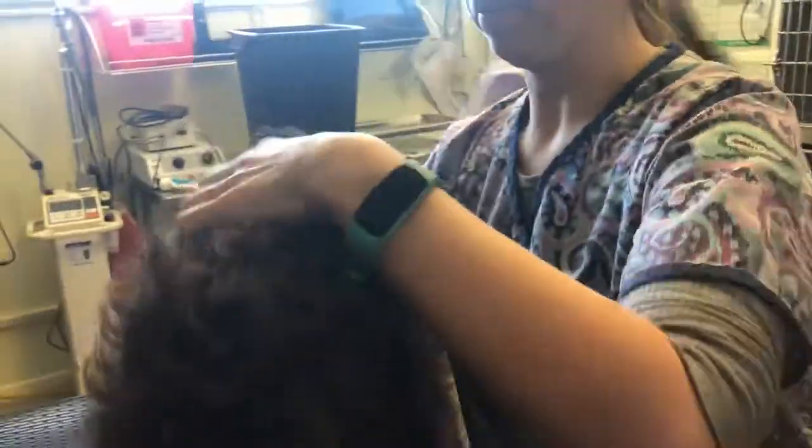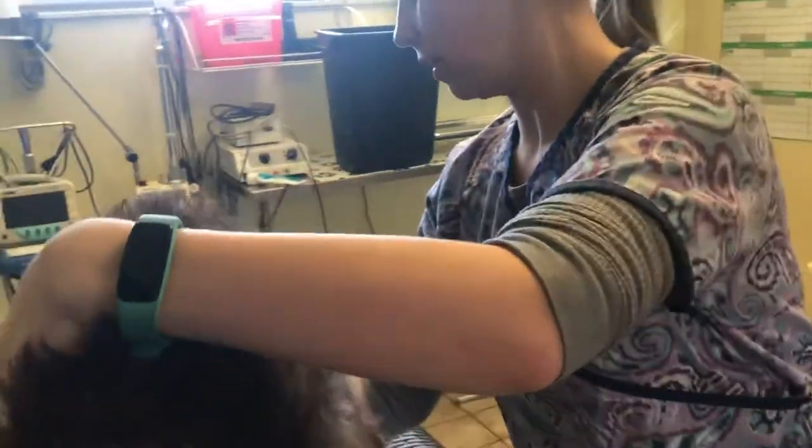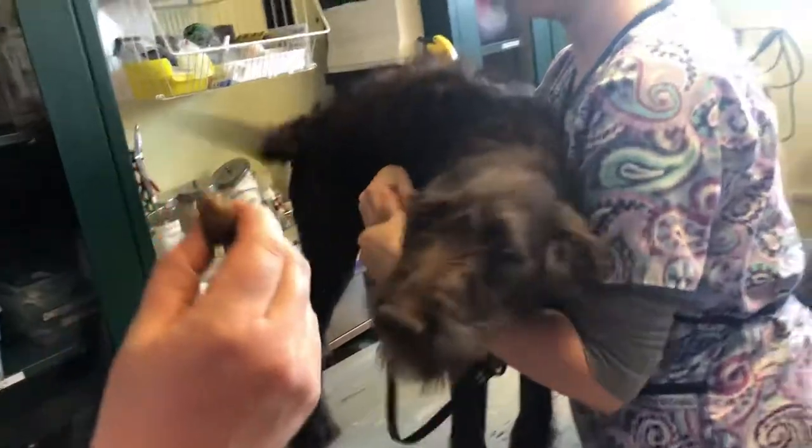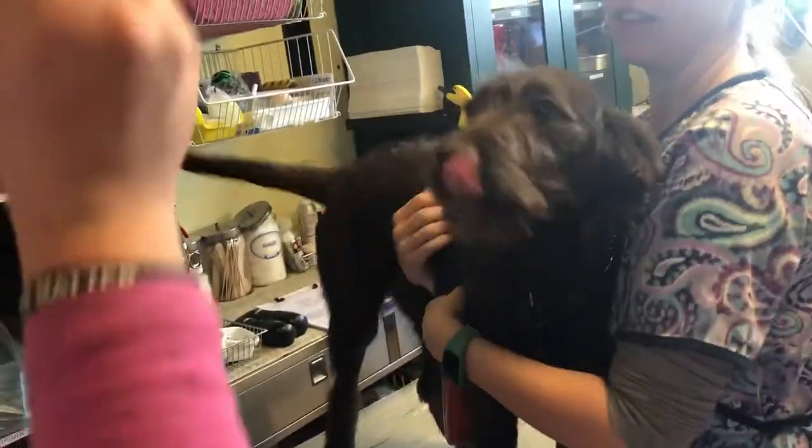So that's a microchip — really easy, pain-free. I usually try to do it the first time we see a puppy, for their first puppy vaccine, because unfortunately we live in a world where people steal puppies and that's the best way that you can prove that puppy is yours. I hope you never ever need it, but if you do, it will be there for the rest of their lives. It's $25 — quick, simple, easy and painless, as Cookie showed you.